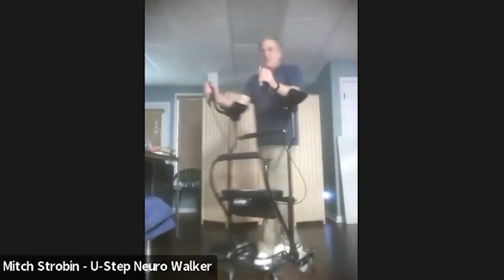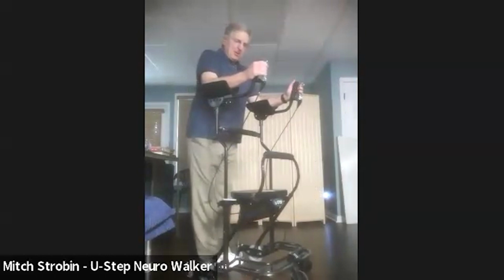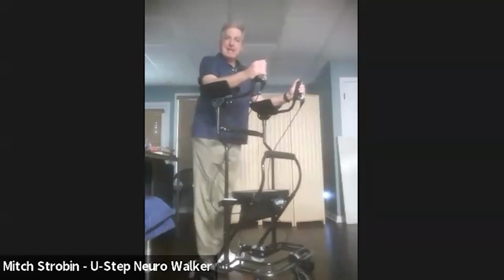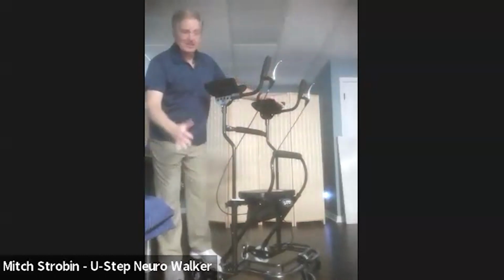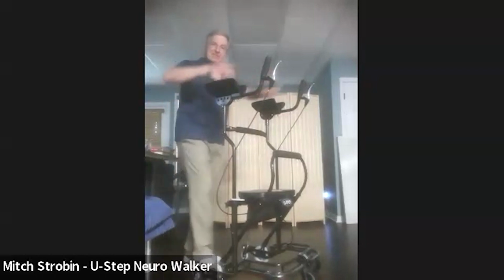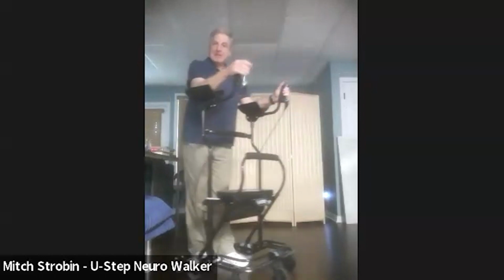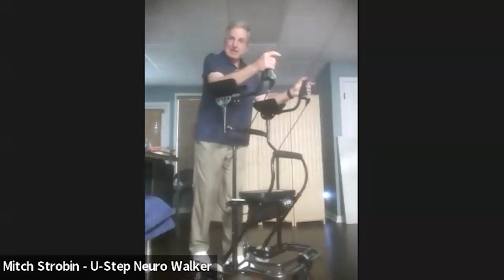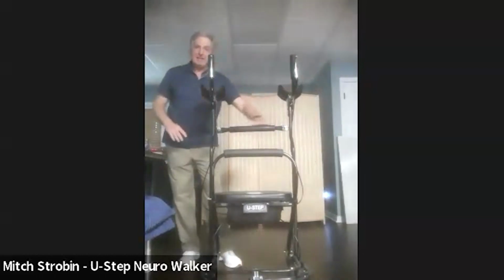So if someone maybe has a stoop posture or a weak upper body and trunk, this is called the platform U-step. Same base, nothing has changed. Now we have different upper sections. We have these cuffs, elbow, forearm. That same bicycle handbrakes. Remember, either hand releases the brakes. We have what we call a stability bar right here that connects the two platforms, else they would just be wobbly. That's not good. So the platforms come as a pair, okay?